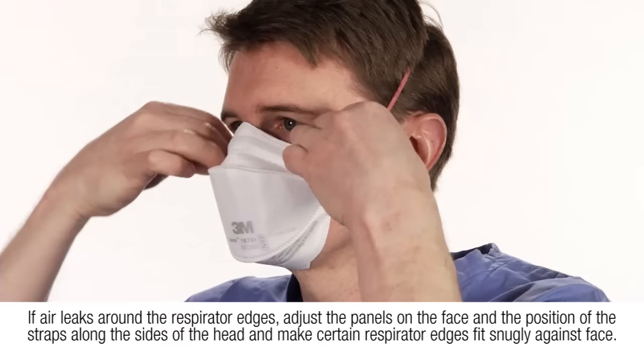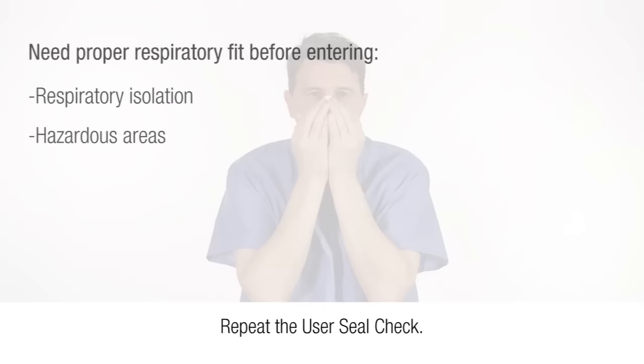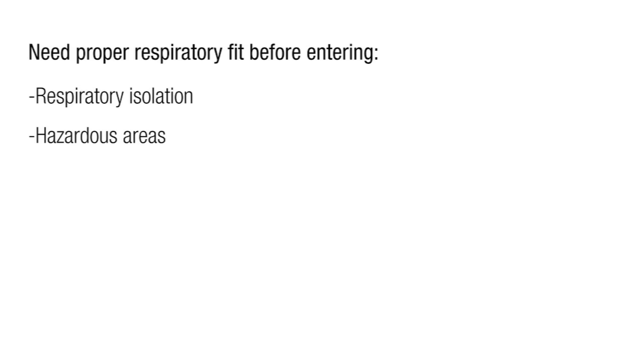If air leaks around the respirator edges, adjust the panels on the face and the position of the straps along the sides of the head, and make certain the respirator edges fit snugly against the face. Repeat the user seal check. Do not enter a respiratory isolation or other hazardous area where respirators are required until you are assured of a proper fit.